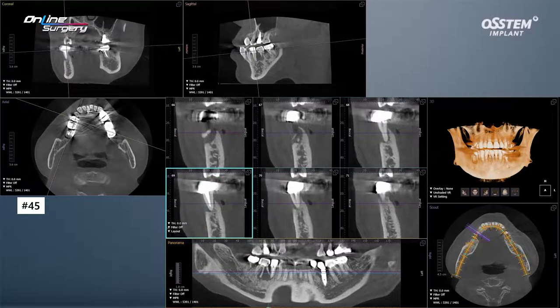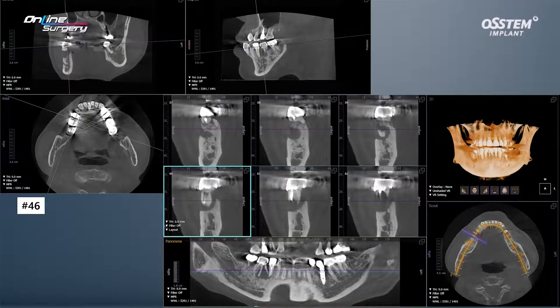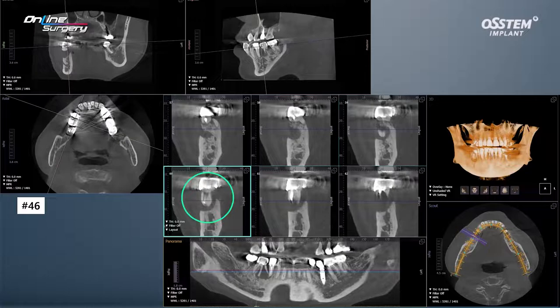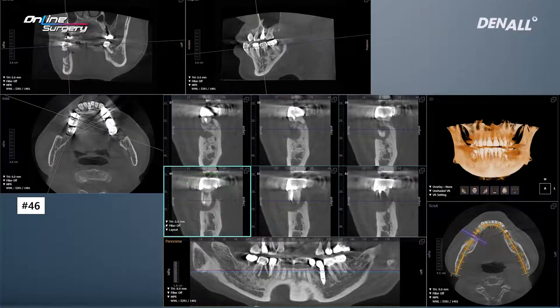There's only a little bit of lingual bone left. In the case of number 46, there's a bit of lingual bone, but the buccal bone is entirely gone.